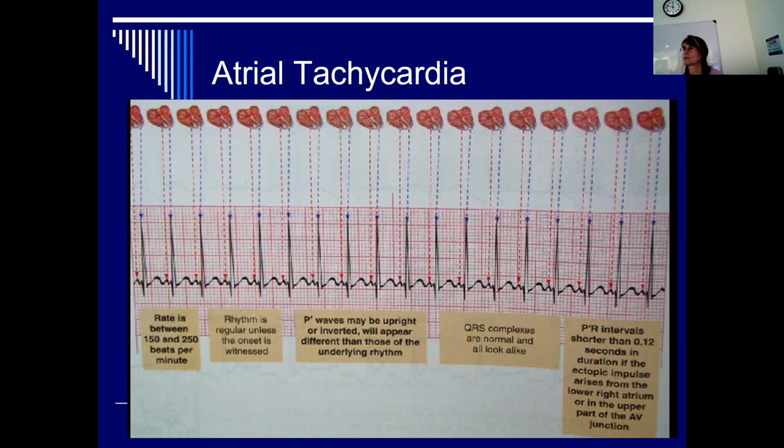I've seen this a bunch of times. We try to use adenosine to shock the heart and then we can see the underlying rhythm. You really can't tell what's going on. That's really fast. And it will usually just happen for a moment, but then we'll have the rhythm strip printing the whole time. Excellent. So we've got a short part of it that we'll be able to show.